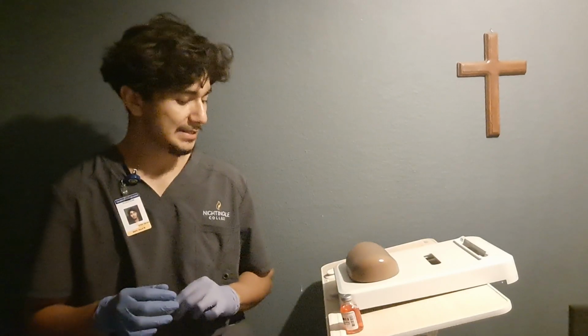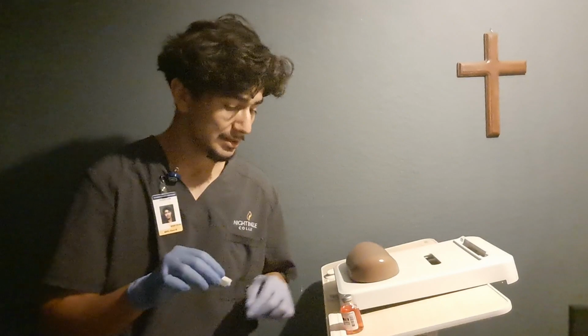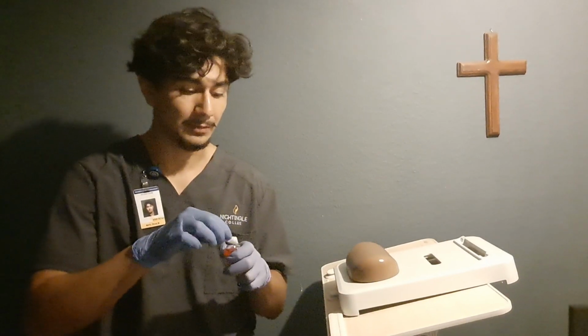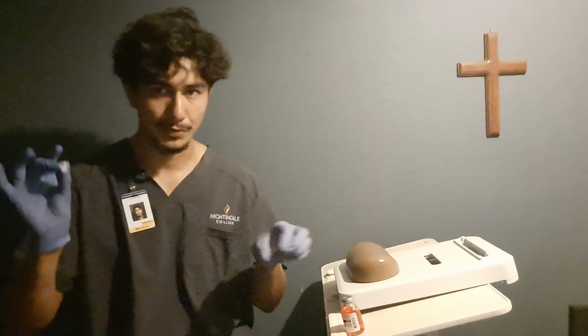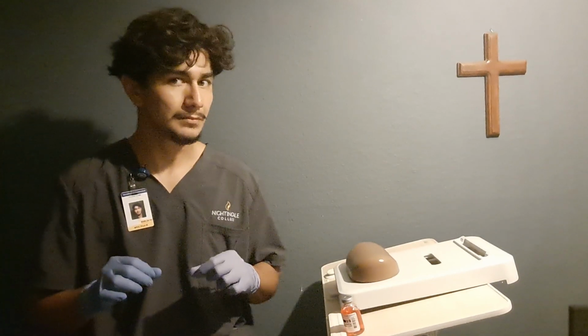Okay, now we place that aside. We're going to get our alcohol prep pad, open it up, pop off the top of the vial, and clean the rubber area. So we're going to let that air dry, dispose of our alcohol prep pad.